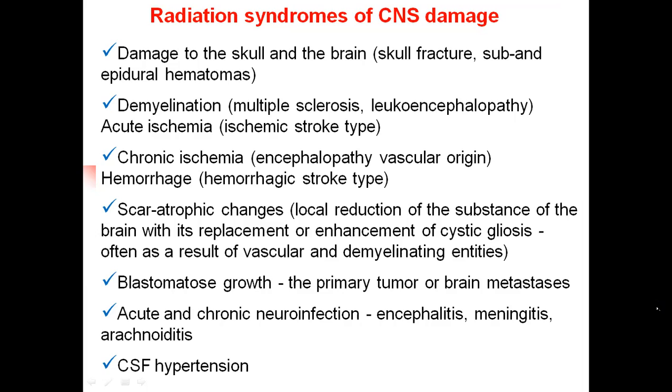First of all, it's damage of the skull and brain traumas, or skull fractures, sub- and epidural hematomas. The second syndrome is demyelination in multiple sclerosis or leukoencephalopathy.